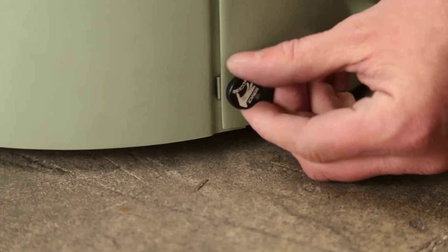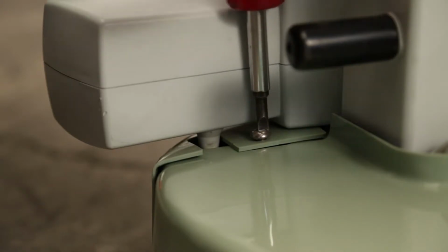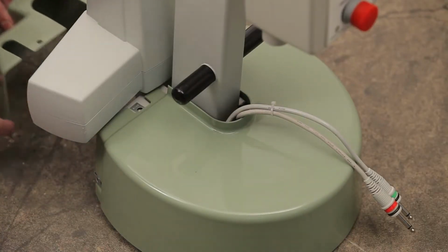Remove the two thumb screws from the side of the lift cover and the two screws from the top of the cover using a flat blade screwdriver. Next, remove the two cover pieces.